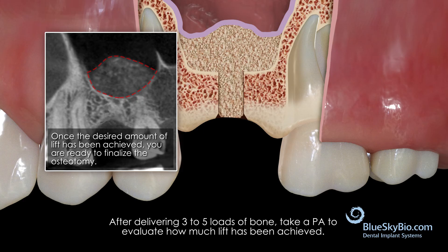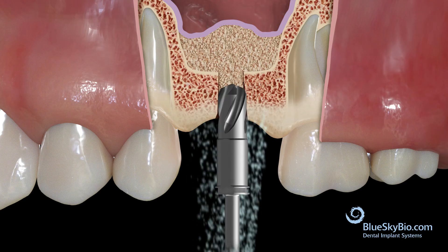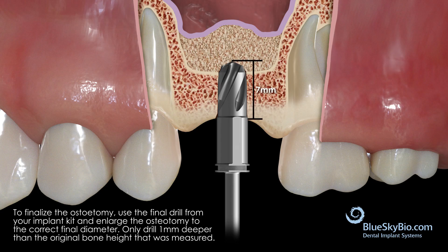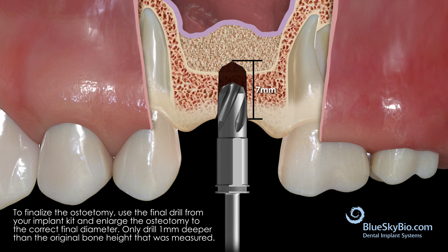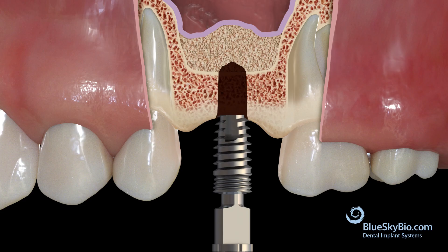Once the desired amount of lift has been achieved, you are now ready to finalize the osteotomy for the implant. Use the final drill for the implant you are placing. It is not necessary to drill to the full length of the implant — rather, just drill one millimeter deeper than the depth of the patency achieved. With the membrane lifted, you can now place the implant.